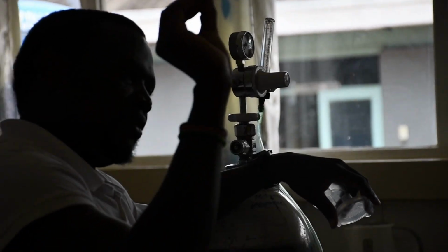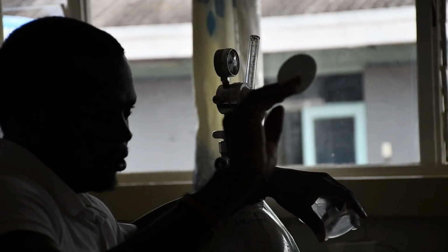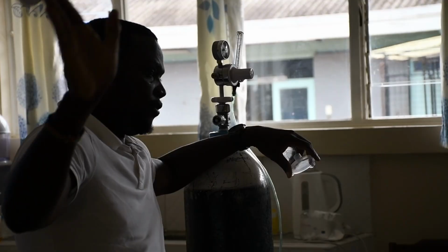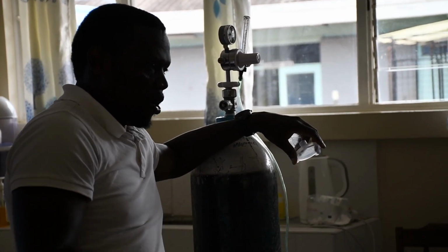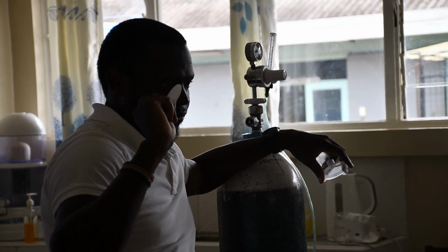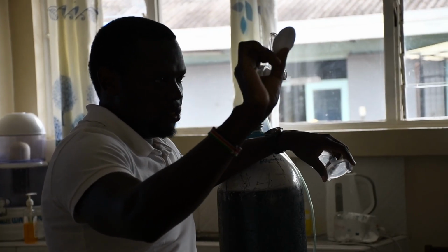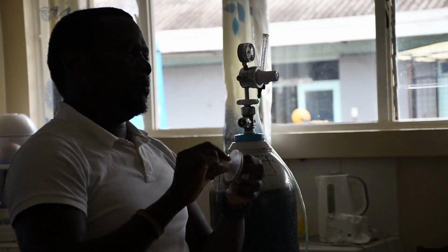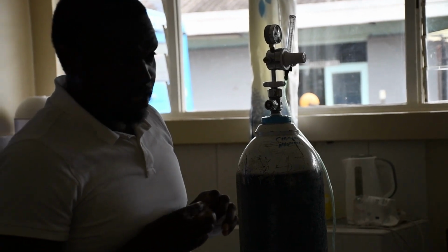When this one turns color, to blackish or brownish from white, you need again to change it. Even if 24 hours has not yet been reached, you need to change it. When you're changing the device from one patient to the next patient, also you need to change it. Okay. So those three conditions have always to be met. These other parts are reusable. Reusability means that you need to reprocess them, then you can reuse them.